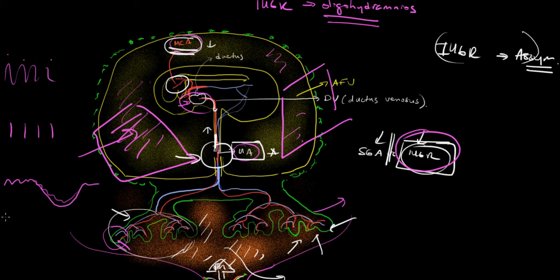The baby's heart's not static, it jumps around a little bit. In chronic hypoxia, after the serious insult, and it has to do with the effect on the myocardium of the heart and also brain effects, because the brain controls heart rate a little bit through the vagus nerve, you lose this variability. You lose this beat-to-beat variability, and you get what's called a non-variable fetal heart rate.